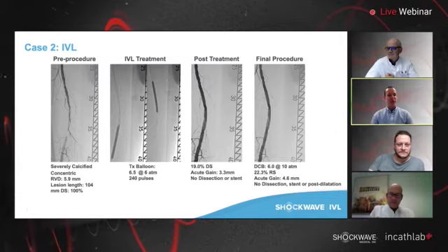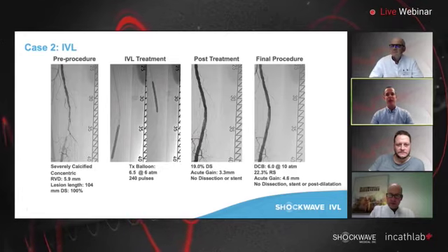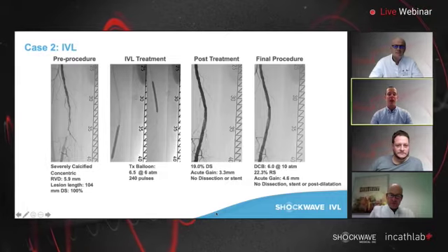So essentially, it's 40-40, POBA with atherectomy. So people divide in a very standard approach with POBA and atherectomy, and we remember that atherectomy, for example, needs a filter. So atherectomy plus filter increases the cost and sometimes also the complexity of this procedure, and only 20% would have gone for IVL. And IVL, as we mentioned before, doesn't require any filter because there's no distal embolization recorded. No one would do anything else. So it's nice to see if maybe the people would change their idea after finishing this webinar.